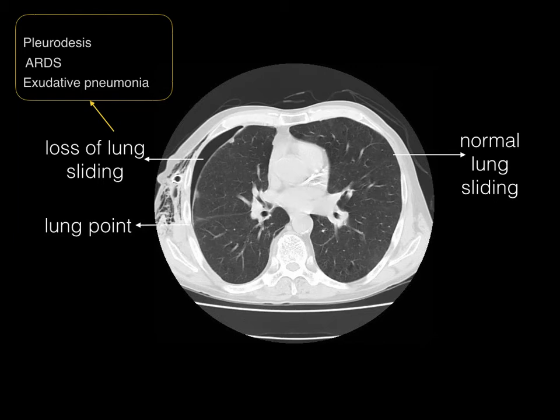This is a very quick case of lung point, which is a very rare sign, so I thought I'd record it for you guys. Basically, when we learn about pneumothorax, what we are aiming for is the first very sensitive sign: loss of lung sliding, which apparently appears on the anterior chest because the air floats to the top. However, loss of lung sliding can occur in many conditions where the pleurals are actually glued together.